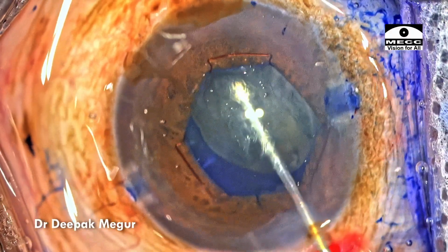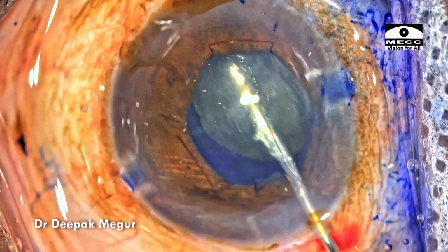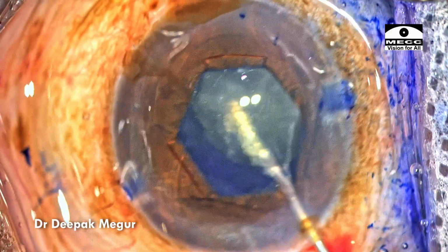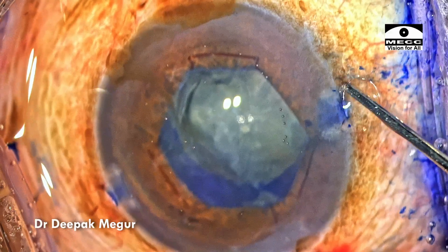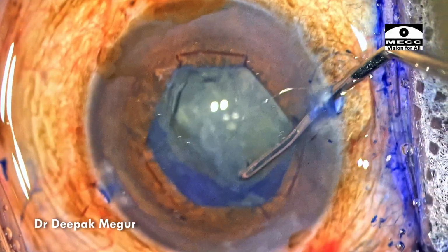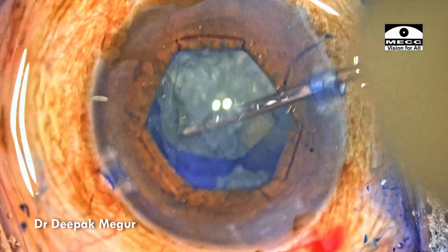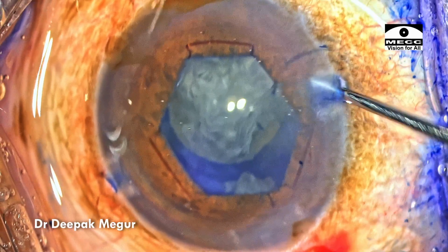I'm trying to nudge the nucleus down and towards center to ensure that the cortical and the nucleus matter is truly separated from the capsular bag. So I inflate the chamber with OVD and then I'm going to use my lens hook just to ensure whether the lens can be rotated. As was evident, the rotation of the nucleus was difficult. The bag is rotating along with the movement of the lens.